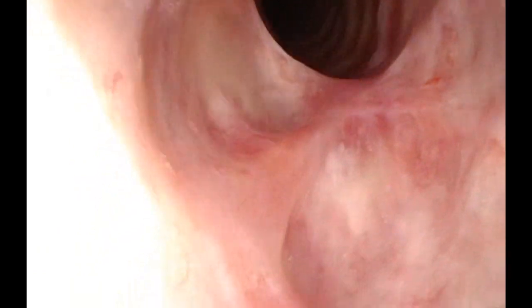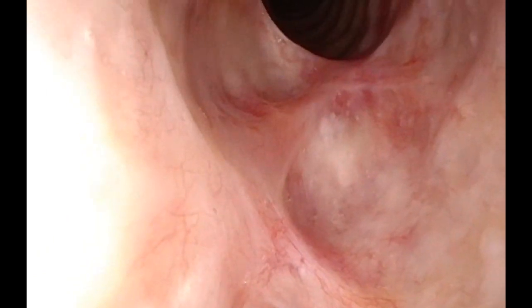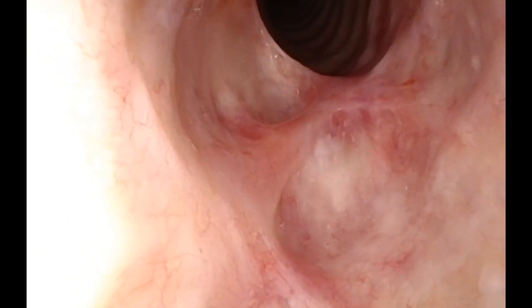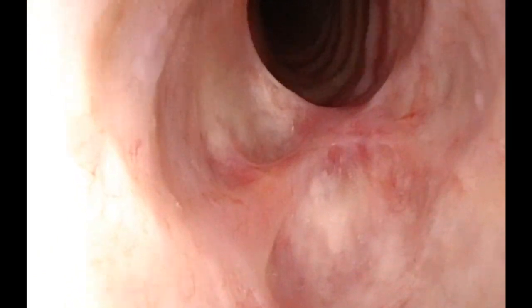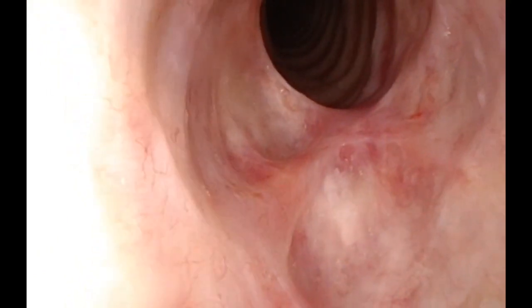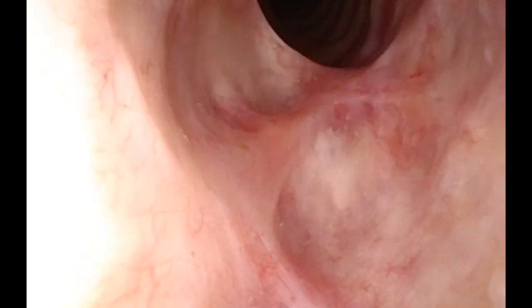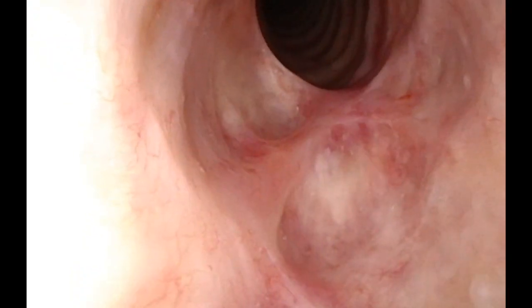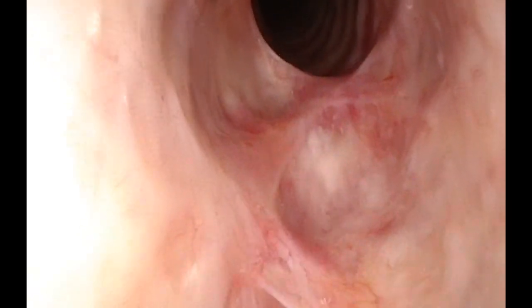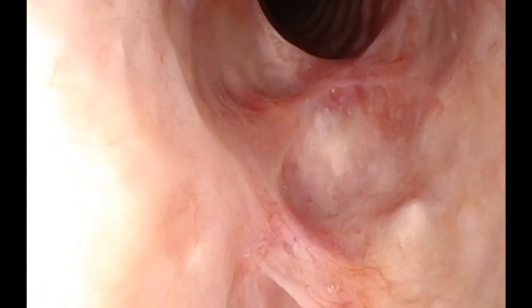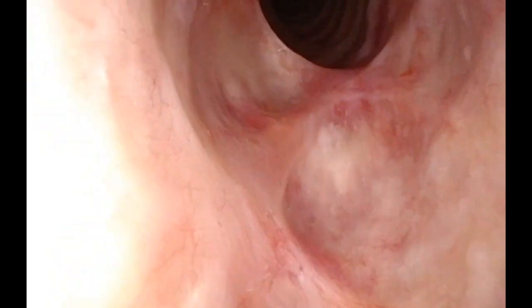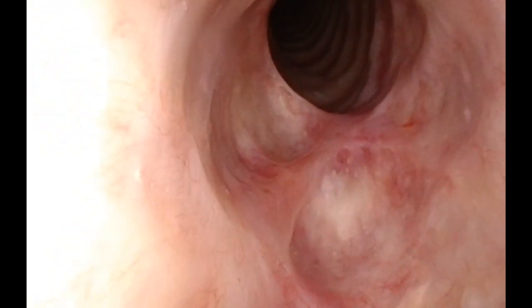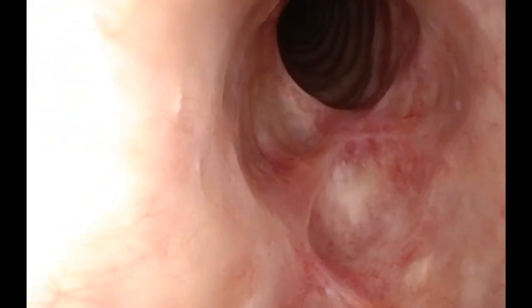In this video you're looking at a subglottic stenosis with an approximate 30% narrowing with some inflammation, with a normal airway below with normal trachea rings.